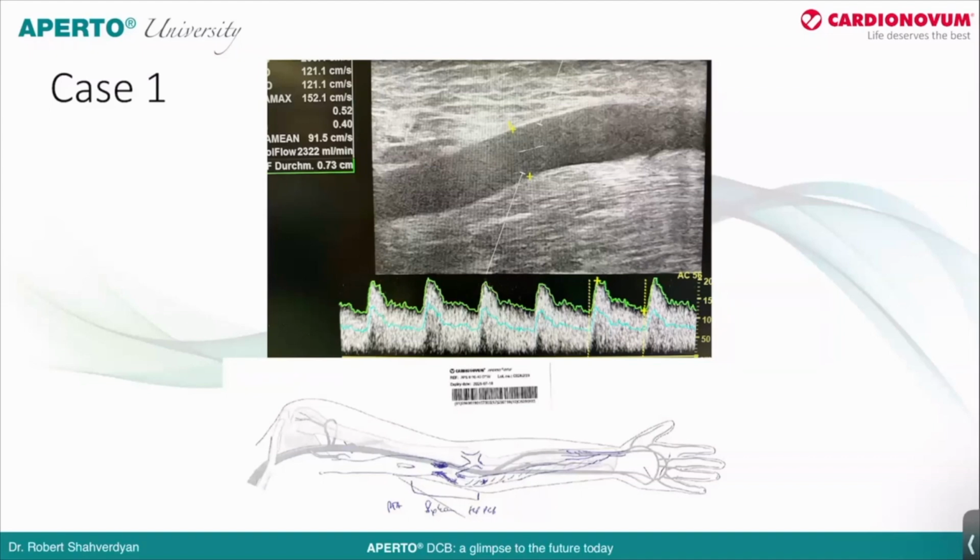And because of some problems with dialysis, another surgical unit decided to remove that banding and created a patchplasty at that region where the banding was. So this treatment led again to an increase of flow. So we're going to reduce it if it stays high enough. But she's stable, so we're still monitoring her. It's a half year already.